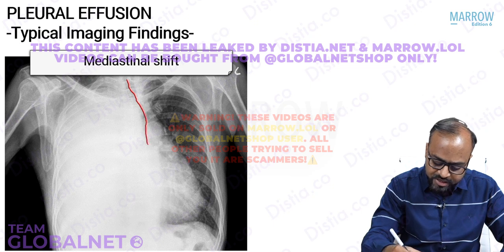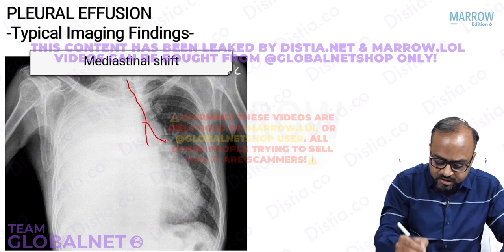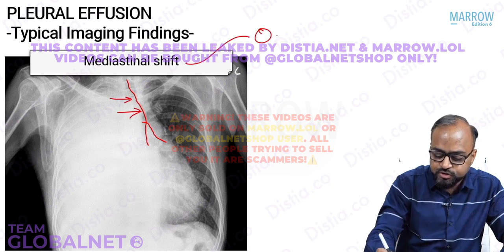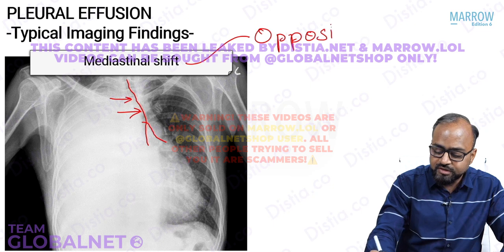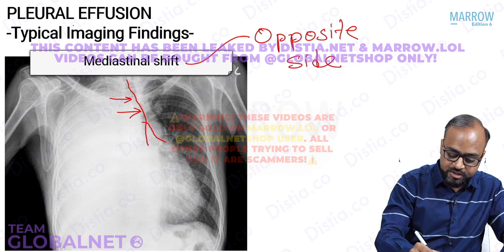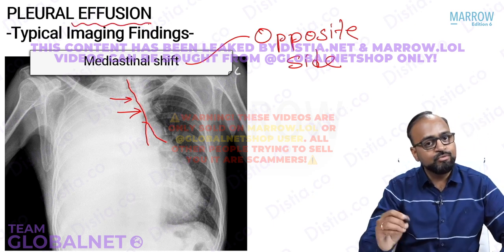And what has happened to the trachea? The trachea is basically pushed to the opposite side. So mediastinal shift is towards the opposite side. And therefore, the underlying predominant cause here, I am saying confidently, will be pleural effusion.